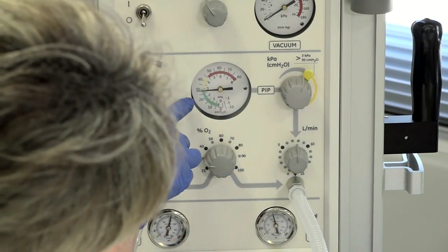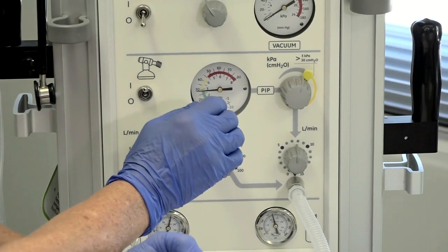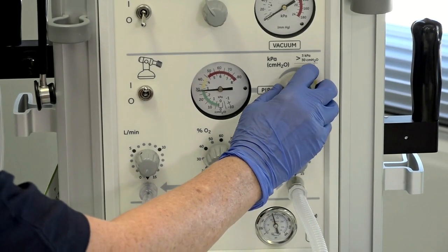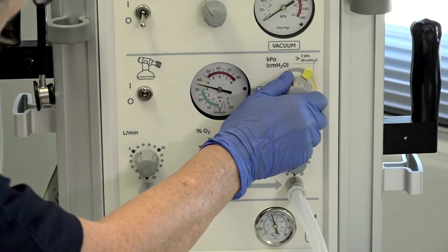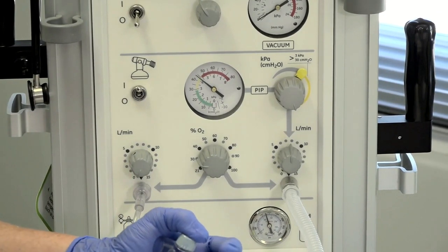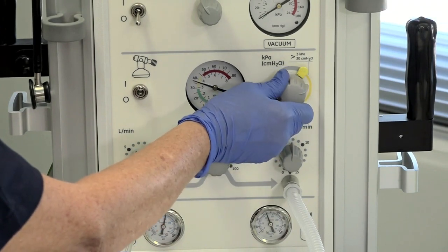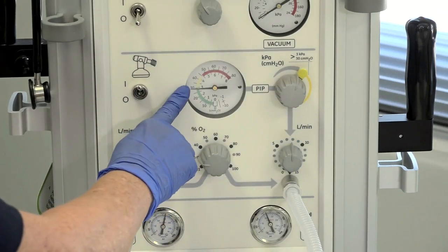Turning it up a bit more, we've got 30 centimetres of water for a baby who is 34 weeks or more. If greater pressure is required, continue turning the PIP dial clockwise, but you'll need to depress the yellow pressure lever — and you can see the pressure increasing. This will only go up to 45 centimetres of water, which is a factory setting. To decrease the pressure, turn the dial anti-clockwise — no need to depress the lever again. You'll hear the click and it's back to 30 centimetres of water.